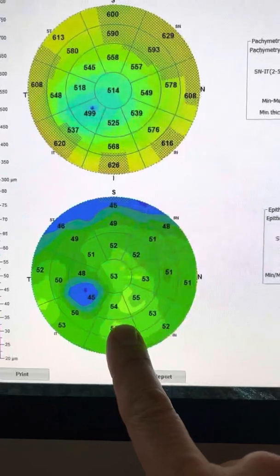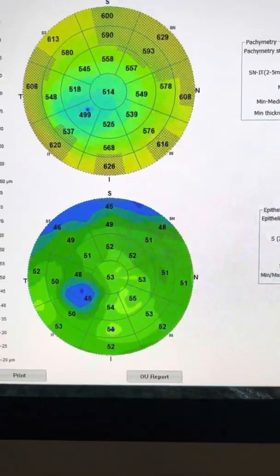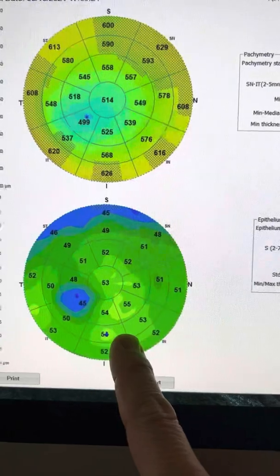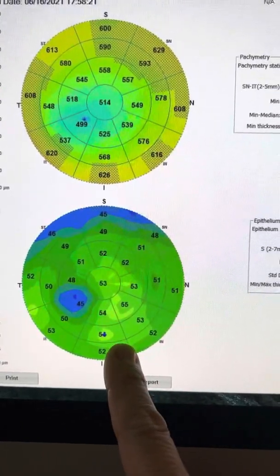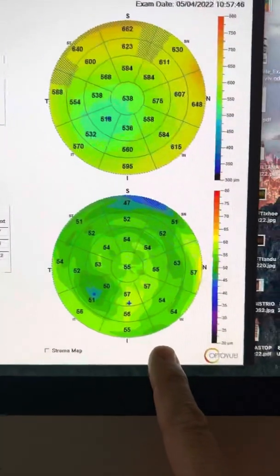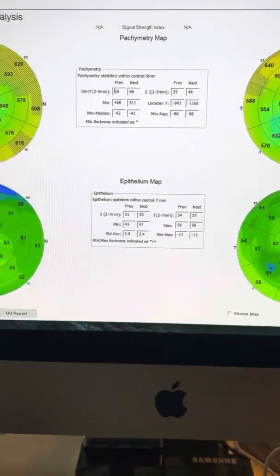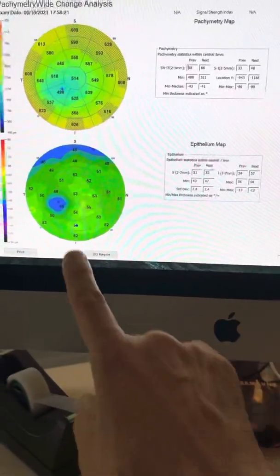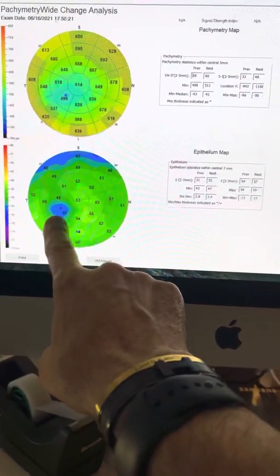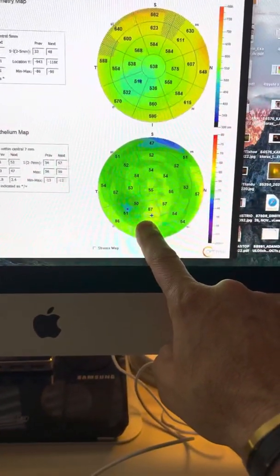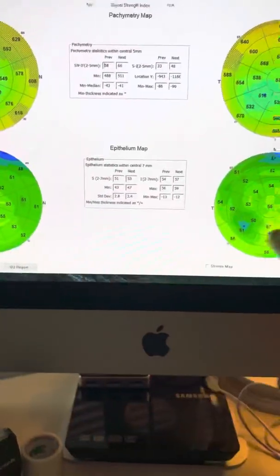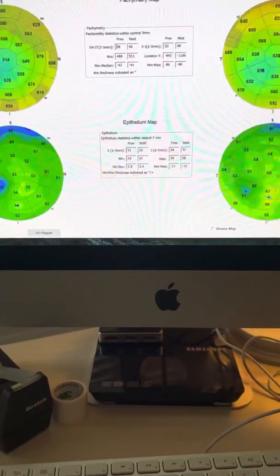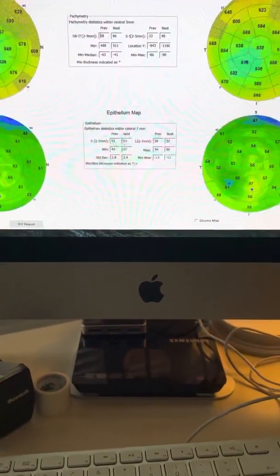And these are the maps from the right eye, which has the mild keratoconus on this young gentleman, back from last year. And this is the same map from yesterday. So we can see here the drastic improvement that the area of the cone has developed through this year.